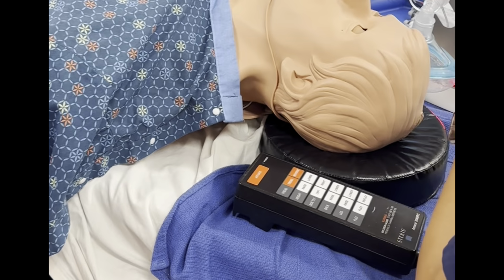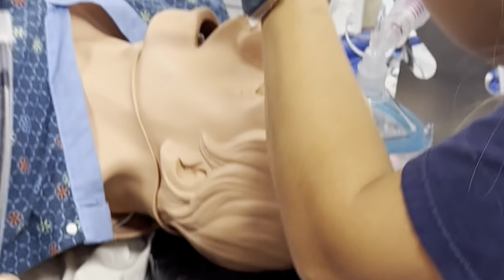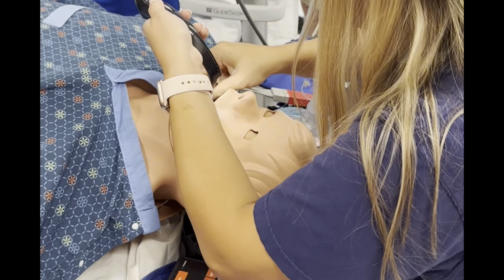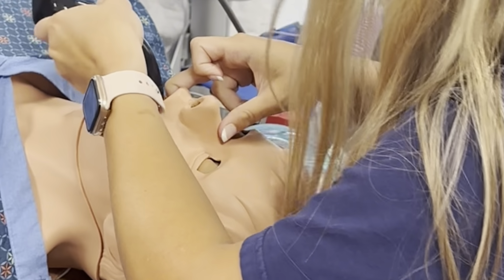All right, so we're going to use the glide scope so all of you can see what it actually looks like. We don't always use a video scope. Sometimes we just use a regular handle that I can pass around and show you. So normally you would turn that screen so they can see. I was just gonna let Mia get a view and then I'll turn.